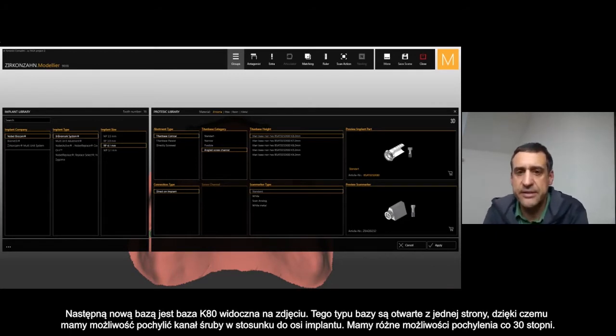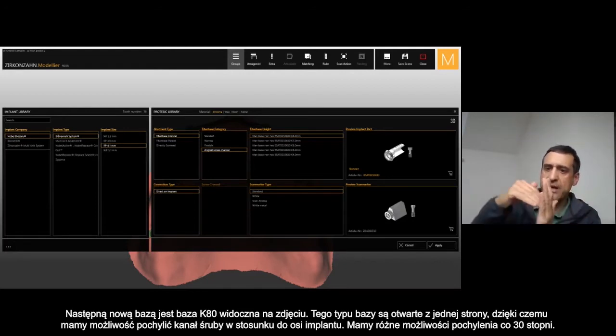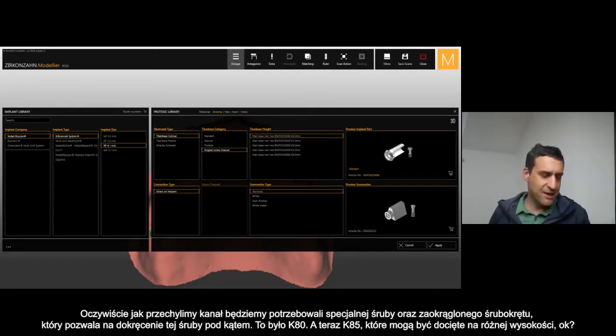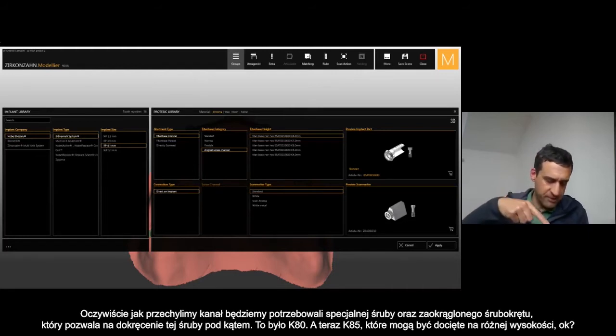The K80 is the T-base that is open — you can see from this picture it's open on one side — and you have the option to incline the channel screw. I have different inclinations up to 30 degrees. It is possible to angulate this channel screw coming out from this T-base. There is a special screw which is rounded, and the screwdriver is also round, which allows you to engage correctly even when the screw is inclinated.